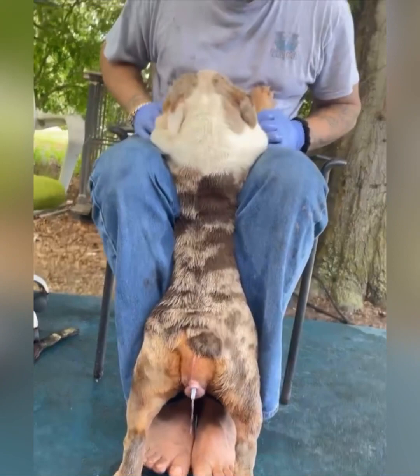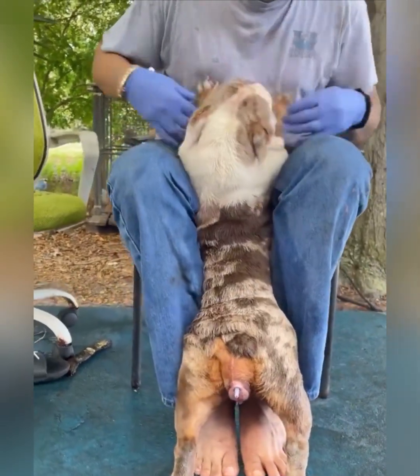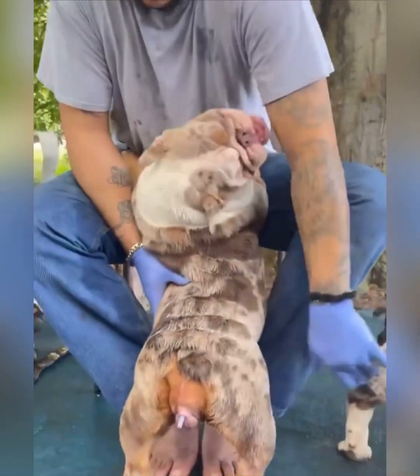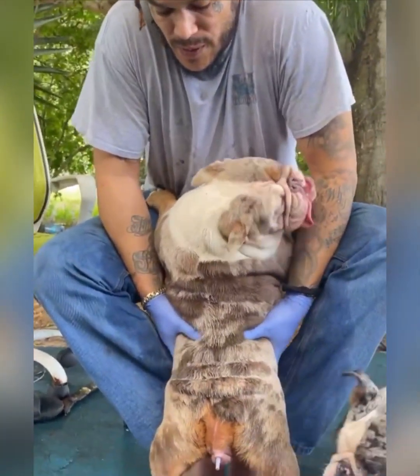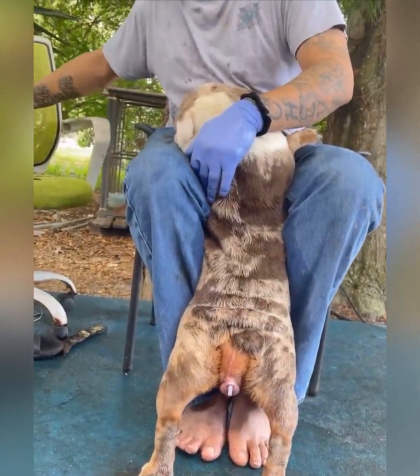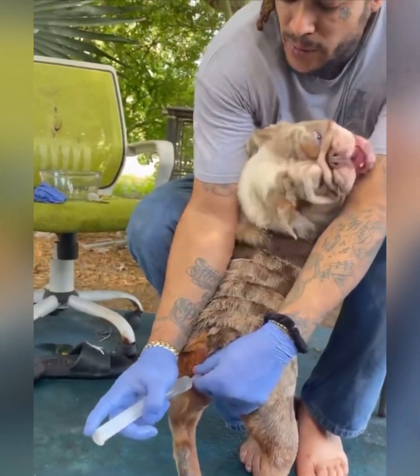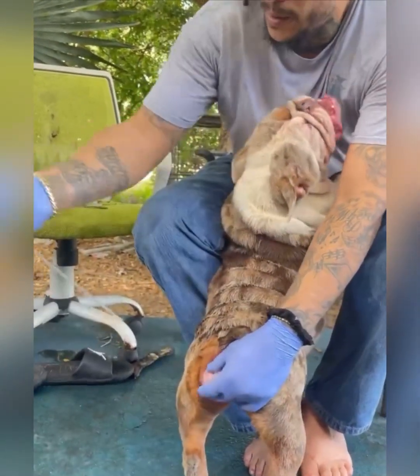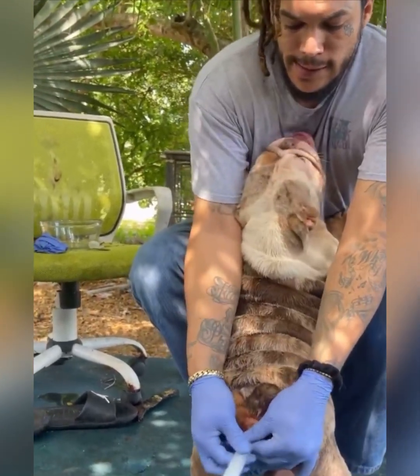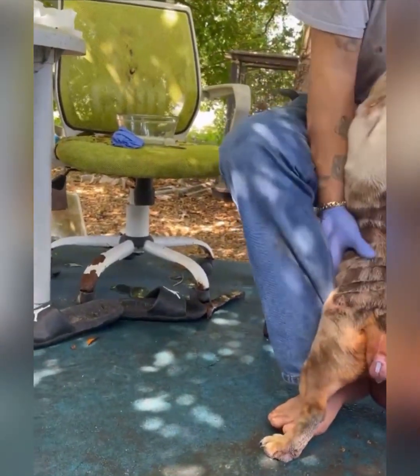Squeeze on her sides gently because you don't want to hurt her, and see it all coming out — just flushing her. That stuff is just saline water. Let me squeeze on her to get it to come out. I'll put a little more flush in there. It's coming out more clear now.